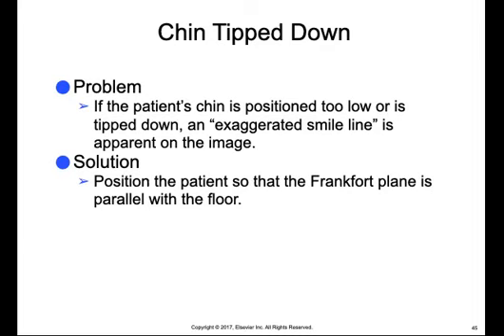And we can see a picture of what that looks like on page 254, where there's a little helpful hint where the Frankfurt plane is tipped down. We can see some examples of that. It almost looks like the panoramic image is giving a ridiculously huge smile. And again, on those images, if we only look at half of the image such that we're looking at the patient's profile, we can clearly see that the patient's chin is tipped down.